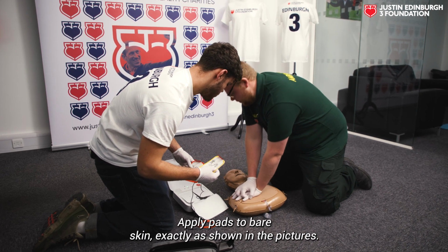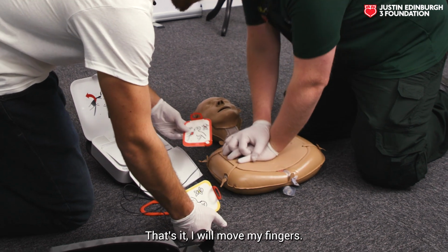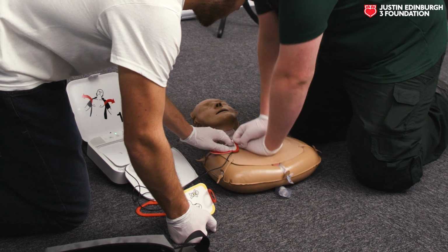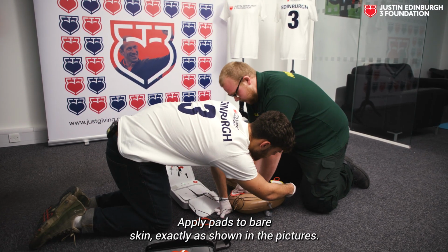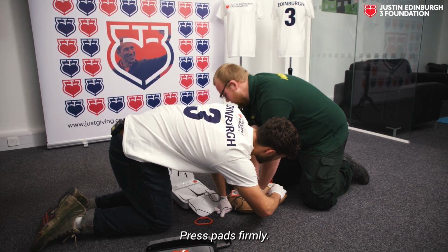Apply pads to bare skin exactly as shown in the pictures. Press pads firmly. Apply pads to bare skin exactly as shown in the pictures. Press pads firmly.